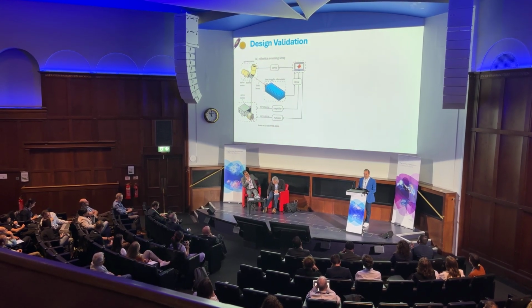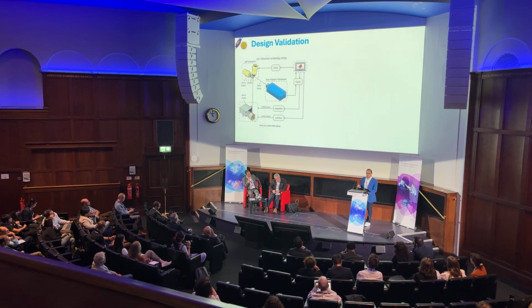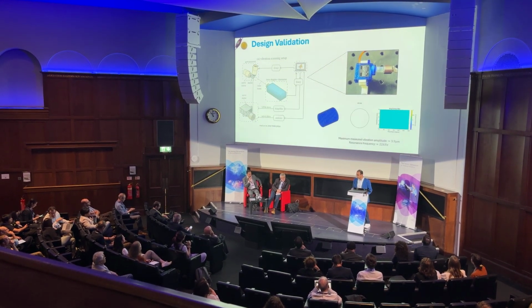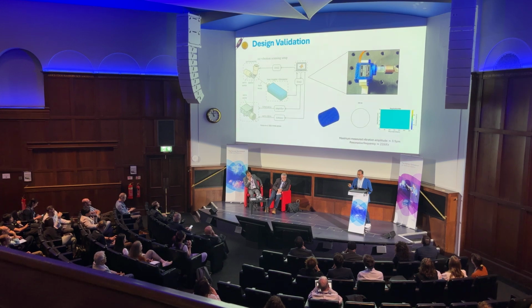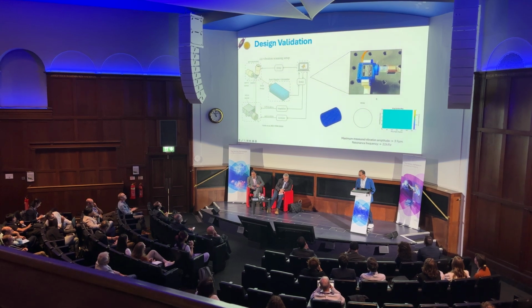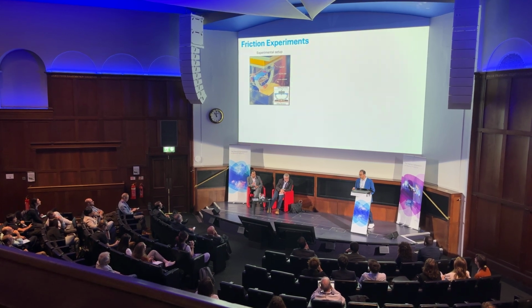To validate this design, we implemented it at different scales. The biggest one was 15 millimeters, the smallest one was 4 millimeters. We used laser Doppler vibrometry to scan the surface of the vibrating elements, and we validated... okay, you have to believe me on that. It vibrates according to its desired design, and it achieved a maximum vibration of 3.9 microns, and it resonates at 22 kilohertz. So now it's time to validate this design in friction experiments.